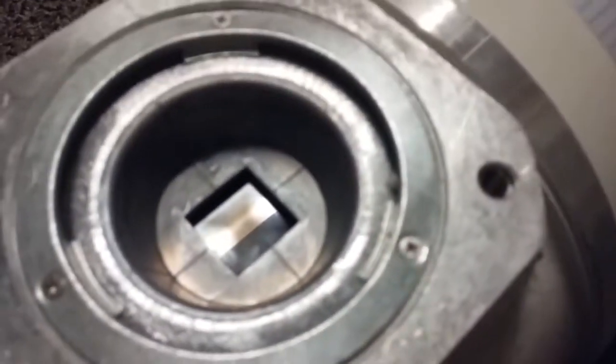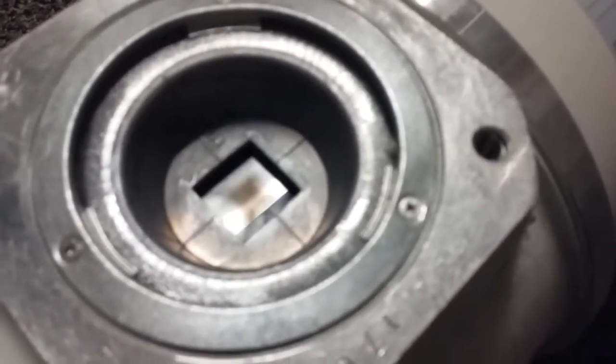This one is totally nice and clean. And this one looks a little bit hazy. This looks hazy.